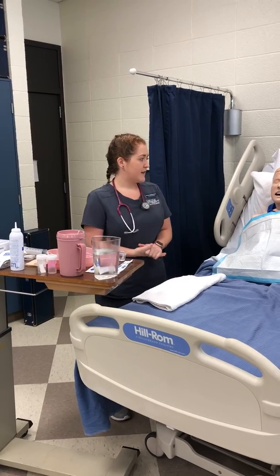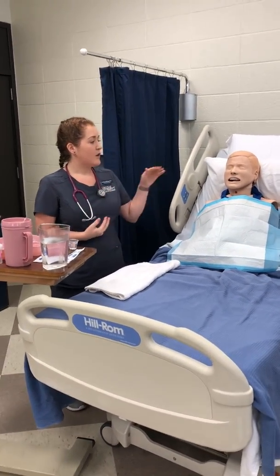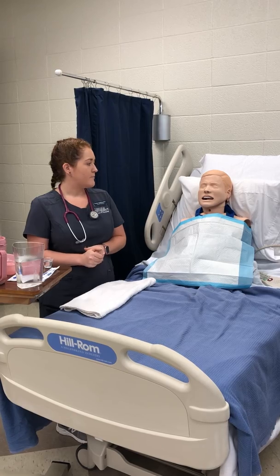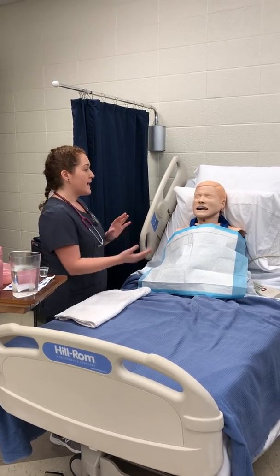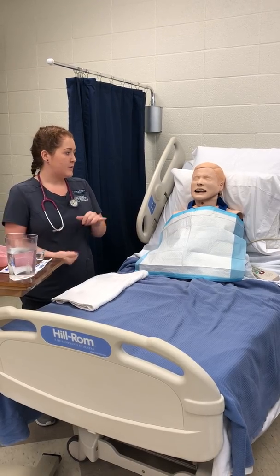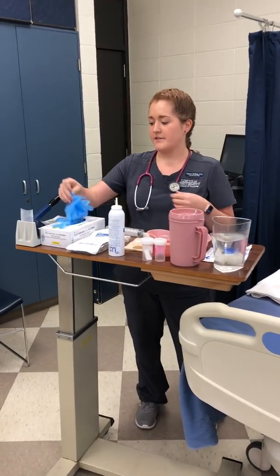Before we get started, I have come in, I have assessed my patient, I have determined the need for an NG tube, and the order is placed. I've explained everything to the client and I have also assessed the patency of both nares to determine which one would be better. I have also asked the patient, whose name is Fred, about any history of nasal surgery, any fractures or deviated septums, and if he has had an NG tube placed before, which nares they used that was more successful. I have identified the client with two identifiers, introduced myself, provided privacy, and gathered all of my supplies. I'm going to go ahead and perform hand hygiene and don some clean gloves.